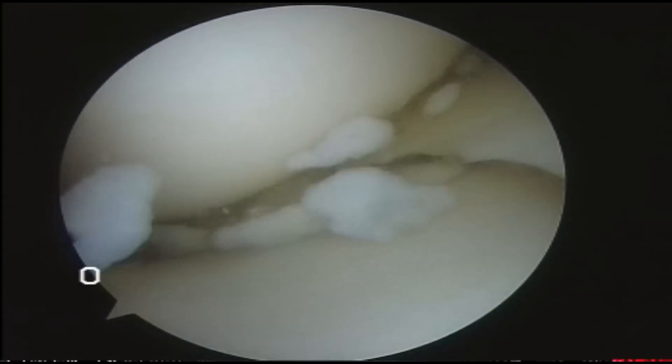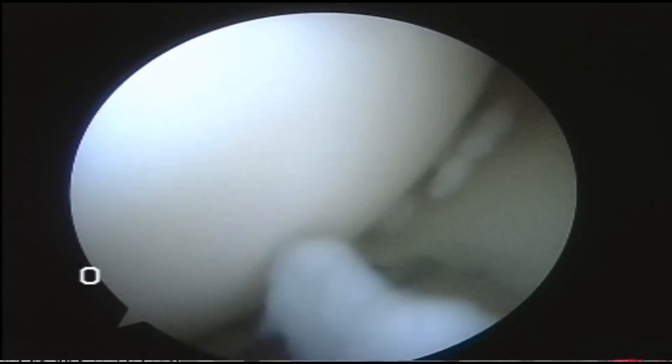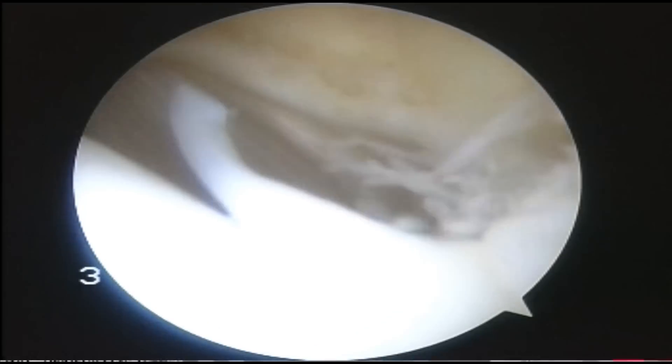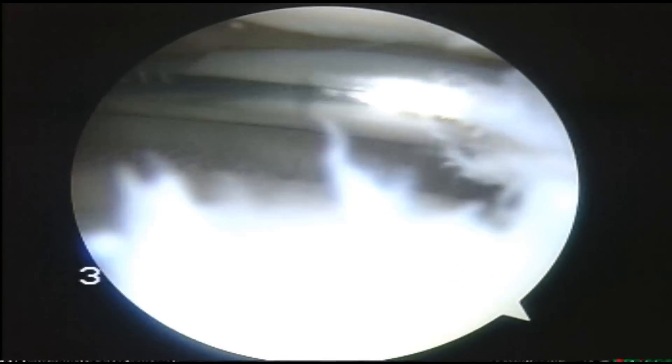There's all the loose bodies. The first thing to do now is to make sure that you find that band and divide it. Take the pressure off that medial plica as it shaves around the medial femoral condyle.